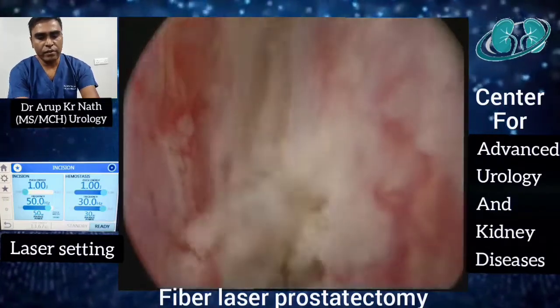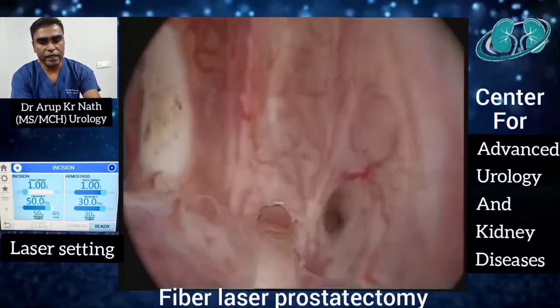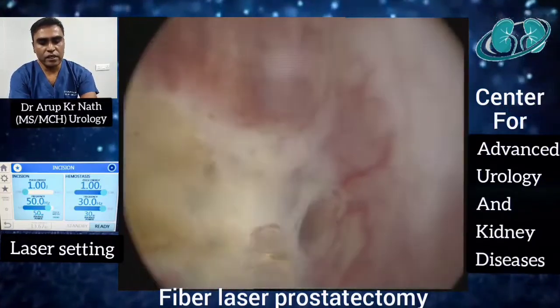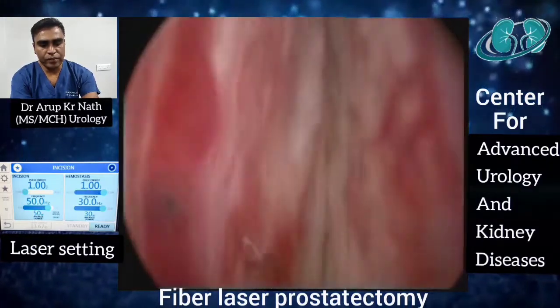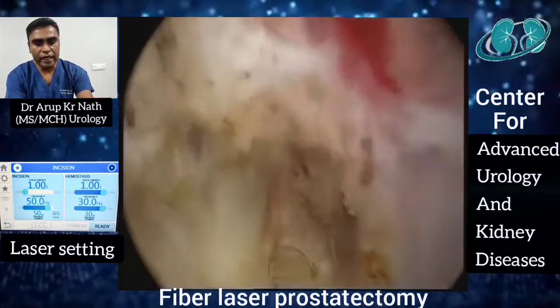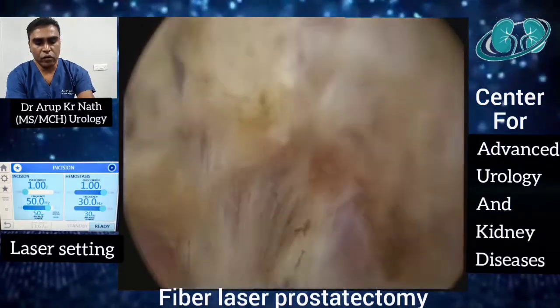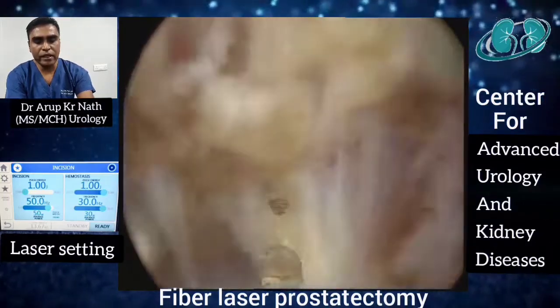You can see a midline incision being made from the bladder neck towards the verumontanum, and the transverse incision has been kept just proximal to the verumontanum. This midline incision we do not complete at this moment — after enucleation of the left lateral lobe and at the floor, we will make the incision complete later.